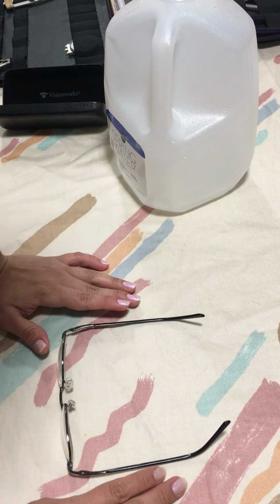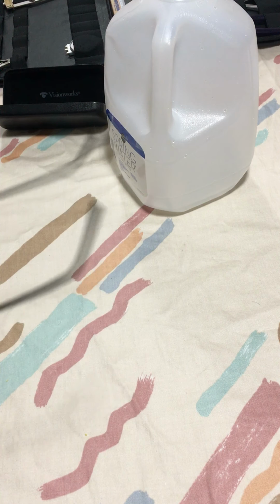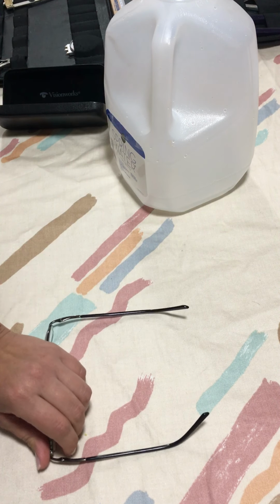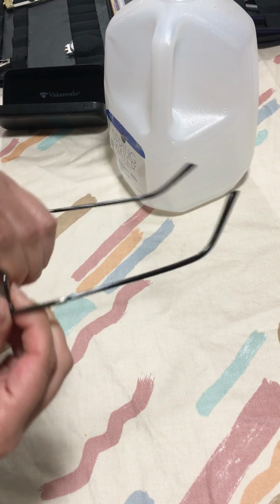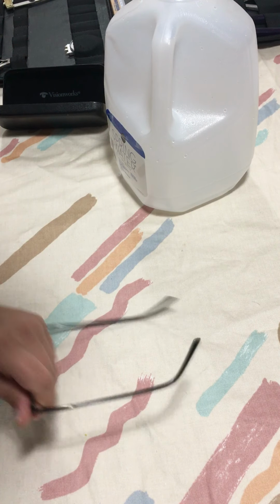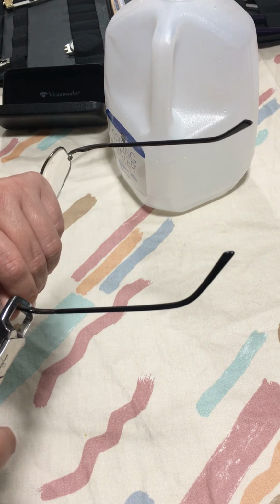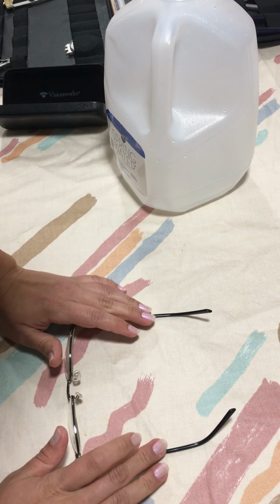So I look at it. It has a little bit of temple parallelism here, which I am going to fix right now. Let's see. See, the lens popped out a little bit. So, no, it's not fixed. So I'm going to grab it hard on the end piece, and I am going to push down a little bit. And now it's good again.